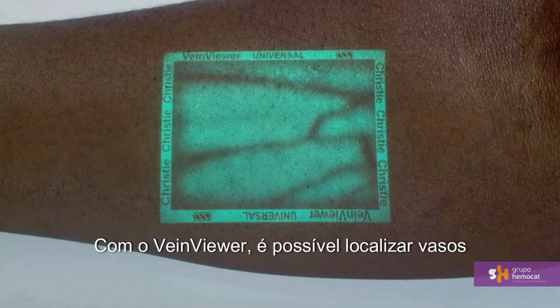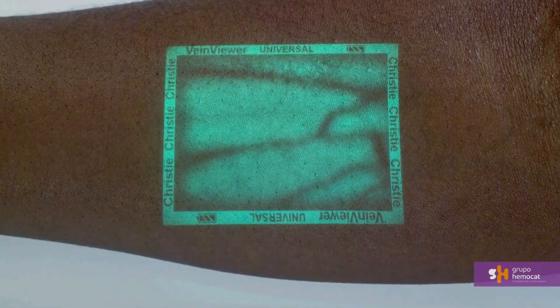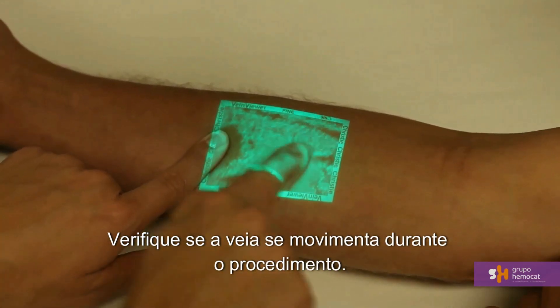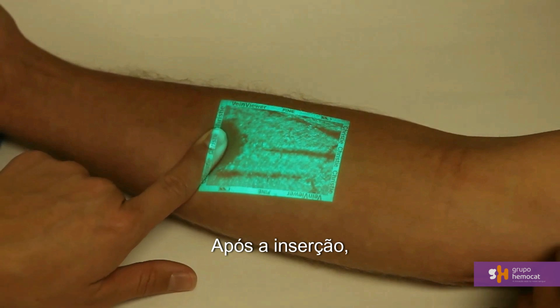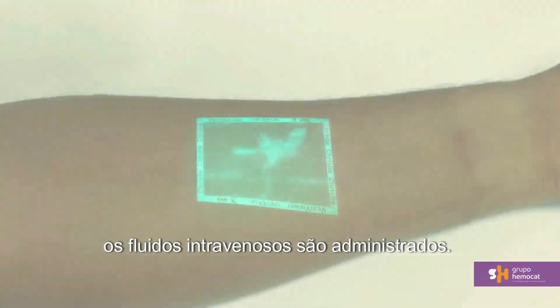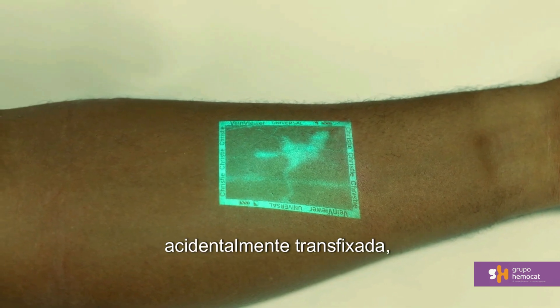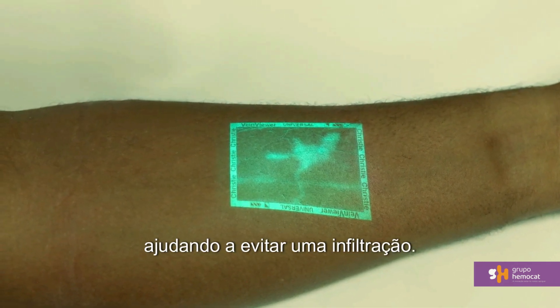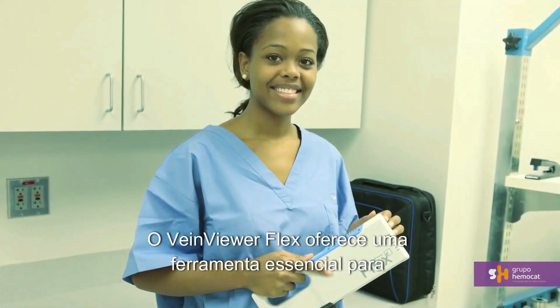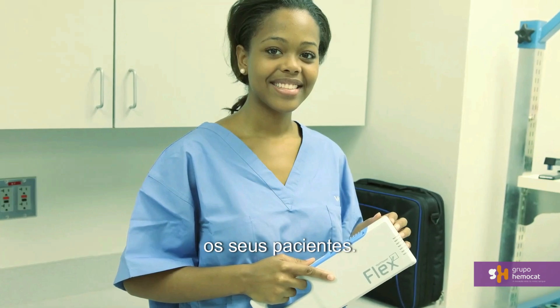With VeinViewer, locate valves and bifurcations not readily detected by the human eye. Occlude the vessel and observe refill. See if the vein rolls during the procedure. After placement, watch blood disperse in the vessel as IV fluids are pushed through. Detect a hematoma forming if the vein is accidentally punctured, and potentially avoid an infiltration. VeinViewer Flex gives you an essential tool to help improve peripheral vascular access for all your patients.